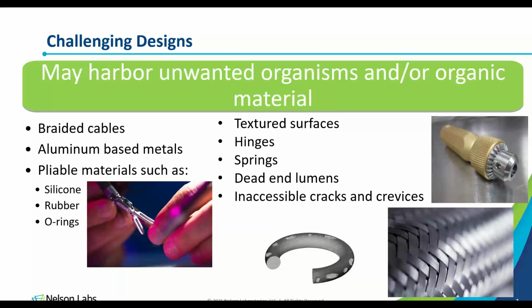And then also allow the end user the needed methods to dry a device. So allow them to use lint-free cloths to wipe it down, or to use filtered pressurized air to dry out those lumens or those cracks or crevices. And that's typically what we see during reprocessing validations, is either of those methods.